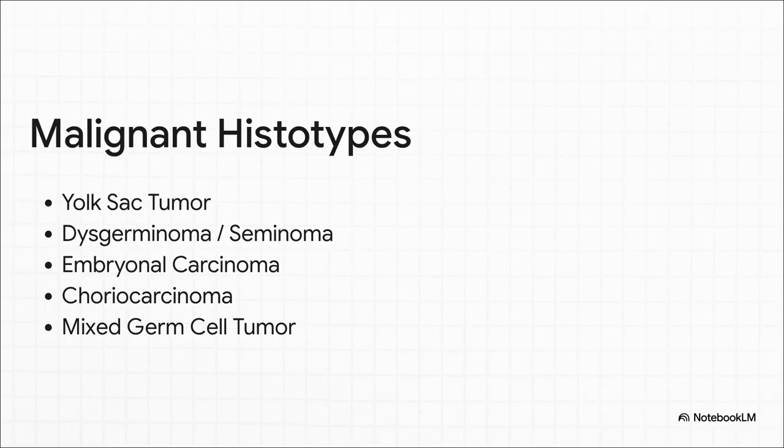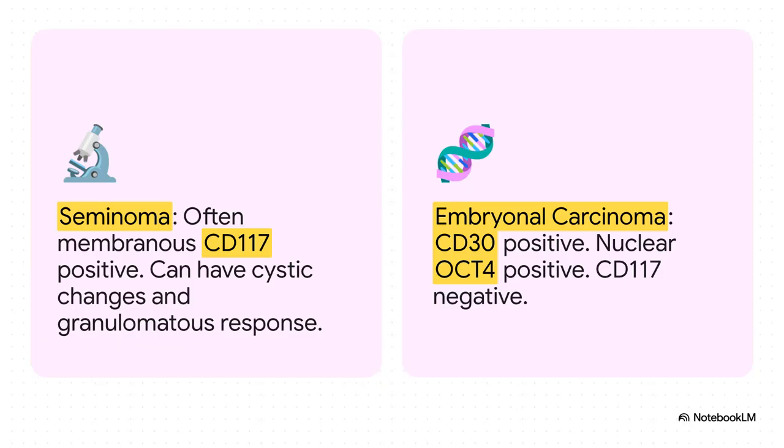Hitting every single component, which is especially important in those tricky mixed tumors. Telling the common types apart is kind of like being a detective. Sometimes the clues on H&E alone just are not enough to crack the case. That's when the protocol becomes your trusty sidekick, guiding you to look for key features and, as we're about to see, those ancillary tests that provide the smoking gun.